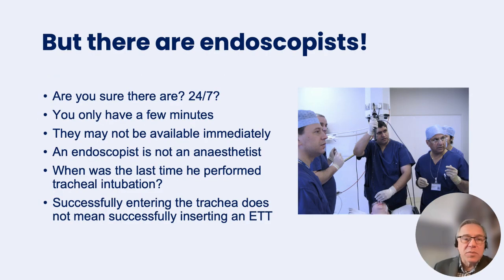You might say, in my hospital we have endoscopists, and they will do it for us if required. But are you sure they're available 24/7? You only have a few minutes in extremis. Will they be available immediately? The endoscopist, remember, is not an anesthetist. They mainly do GI endoscopy and other types of endoscopy. Ask them when was the last time they performed tracheal intubation. Also, the fact that they successfully entered the trachea with the scope does not mean that they can successfully railroad the tube and insert it into the airway. So it's not the answer. You need to know how to do it.